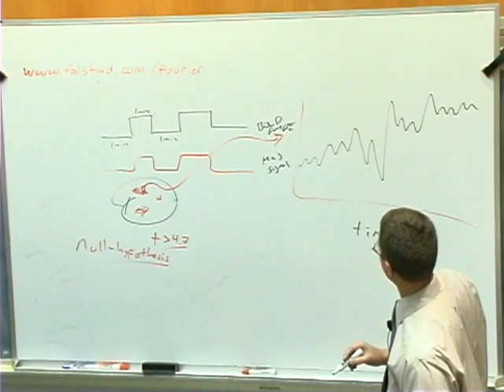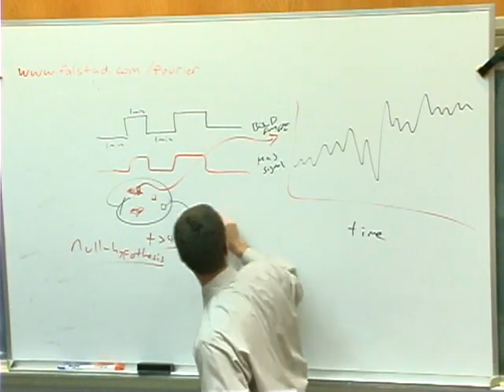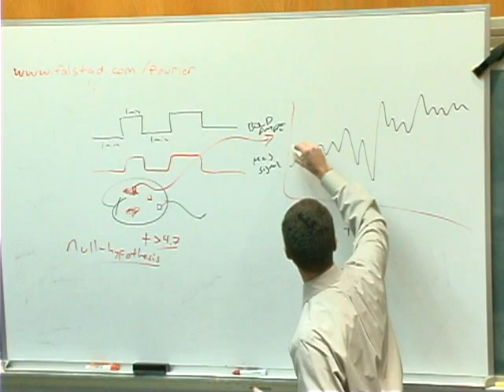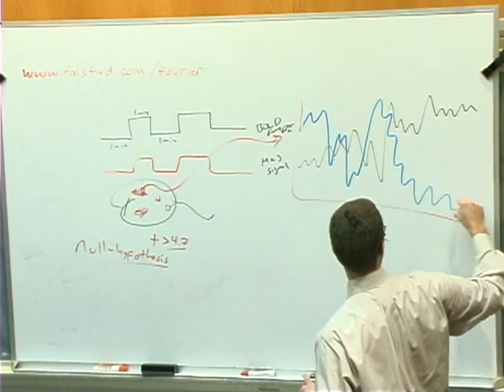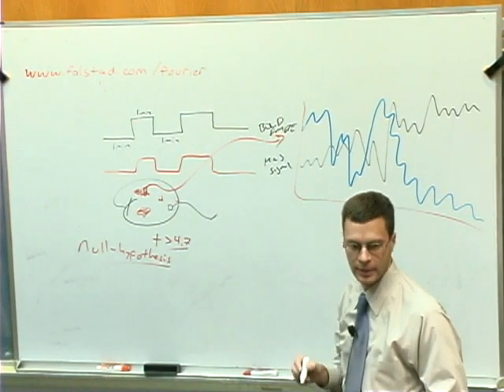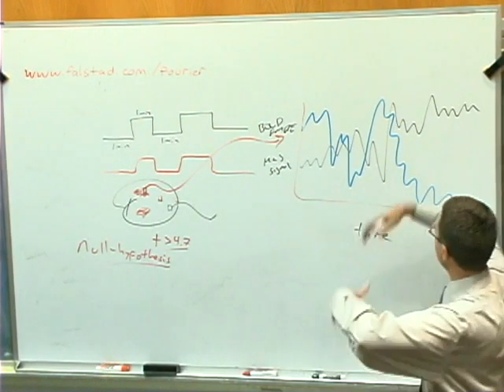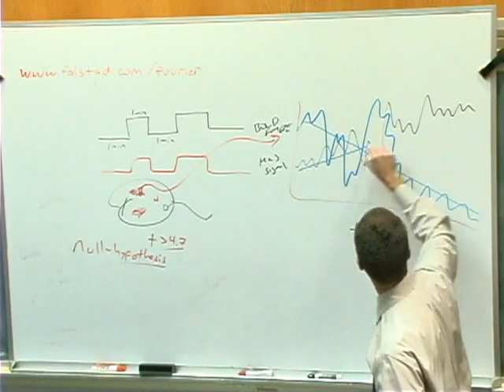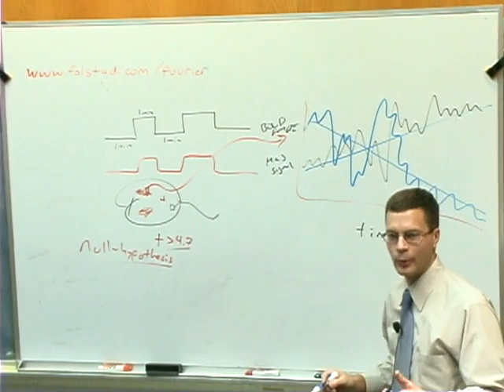Now you pick another voxel. What does that voxel look like? You plot that one, and it looks like this. Like that, and so on. And you say, okay, there seems to be an awful lot of wavy up and down stuff, and also some big linear drifts where the signal seems to be either rising or falling over the course of the scan. So what's another way that I could try and interpret this?